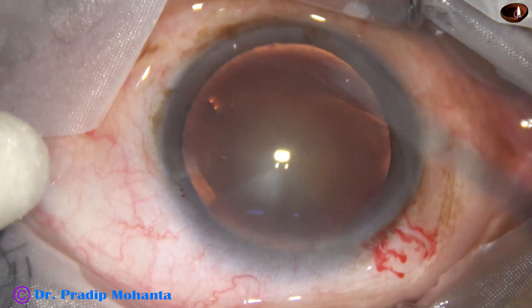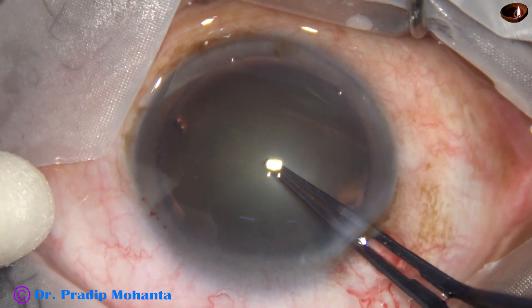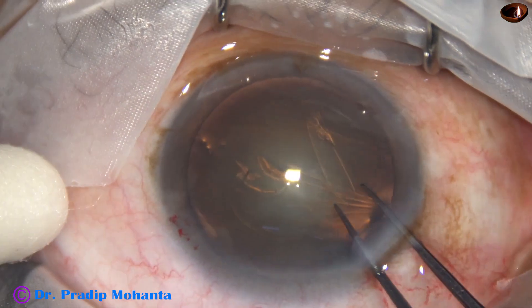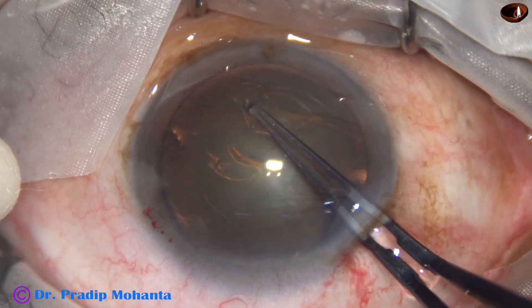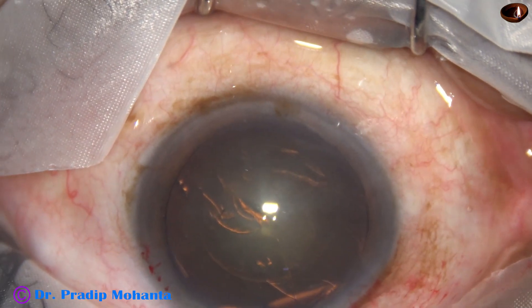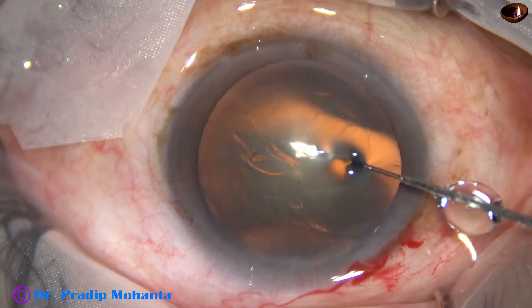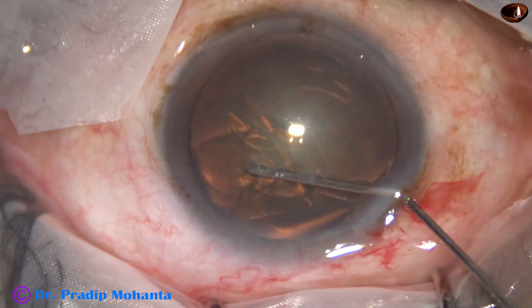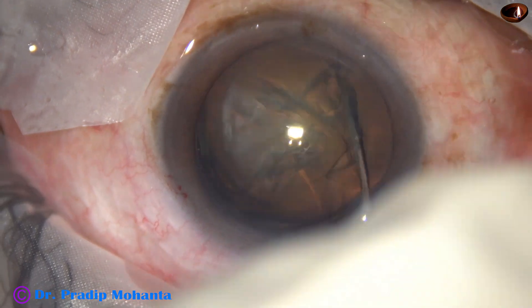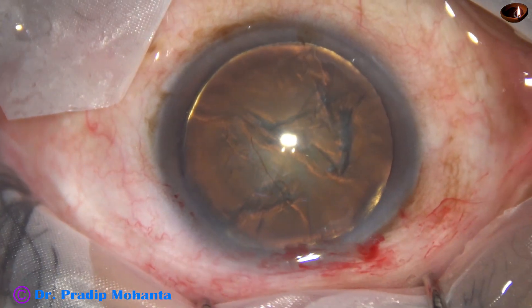By this time, the main incision and the side port has been made. The anterior chamber has been filled up with visco, and now this is capsulorhexis with utrata forceps. The size of this rhexis is about 5.25 mm. Now hydrodissection is done. We must see that the fluid wave goes from one side to the other side. We have seen that the fluid wave went to the other side, and on more hydro, the nucleus rotates. Now the anterior chamber is filled up with visco again.